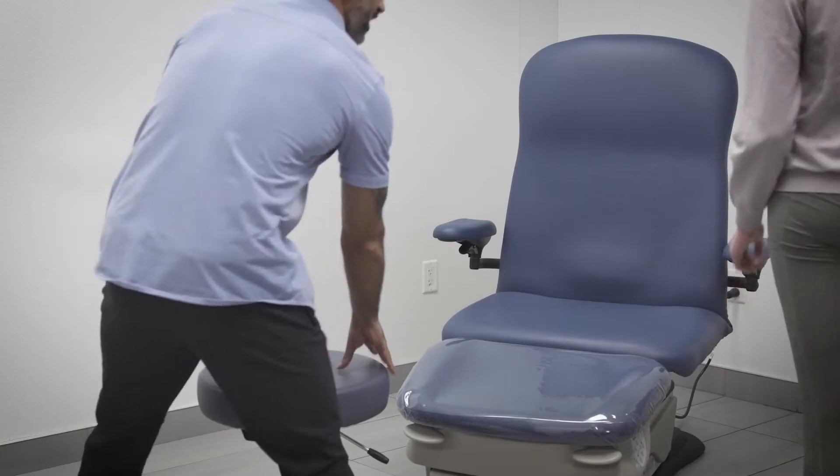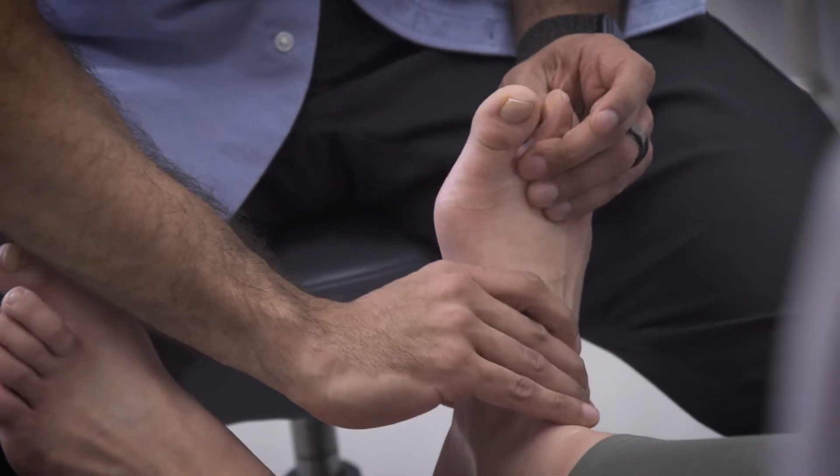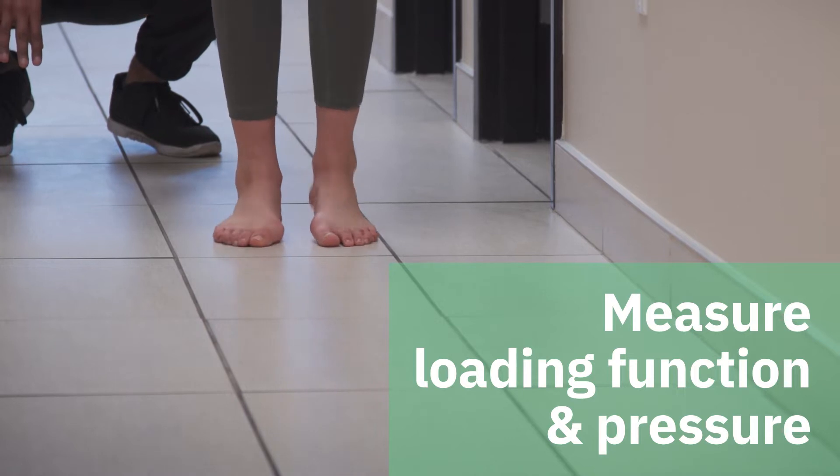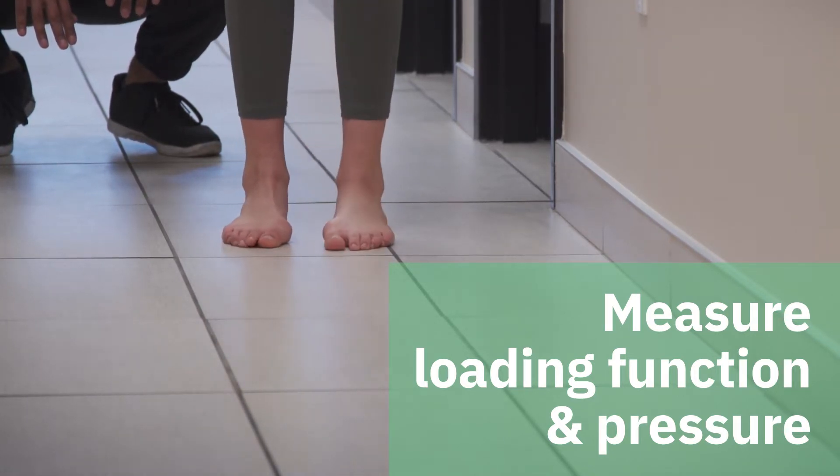The evaluation of plantar pressure and foot loading can provide key insights for clinicians to understand gait impairment and improve mobility and foot function. Improving gait and foot function requires practical measurement of baseline, progress, and intervention effectiveness.